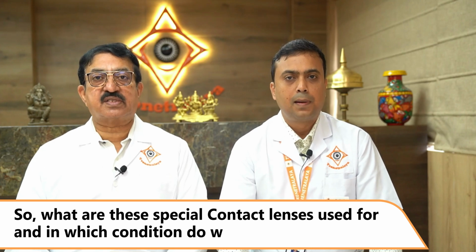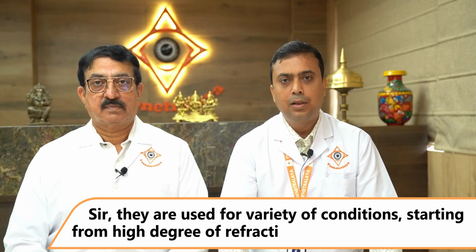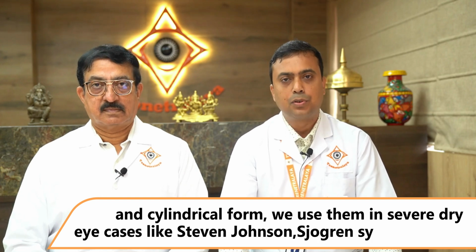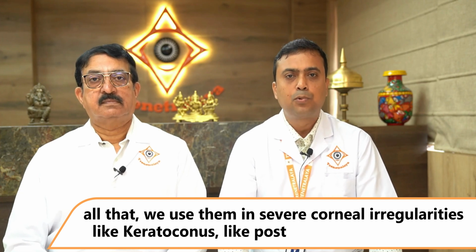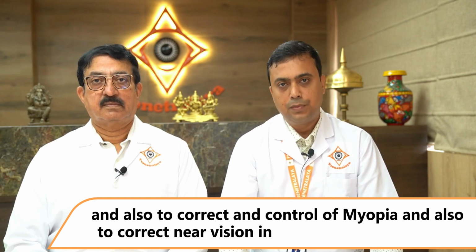So, what are these special contact lenses used for? In which conditions do we use them? Sir, they are used for a variety of conditions, starting from high degree of refractive error, both in spherical and cylindrical form. We use it in severe dry eye cases, like Steven Johnson's syndrome and all that. We use it in corneal irregularities in severe cases like keratoconus, like post-refractive surgery cases, and also to correct and control myopia, and also to correct near vision in multifocal contact lenses.